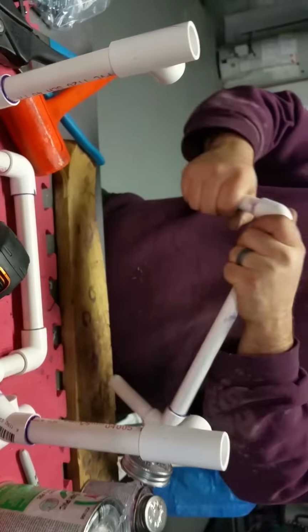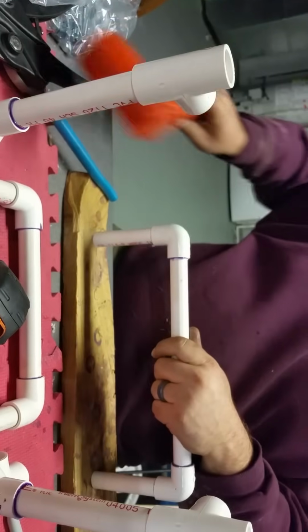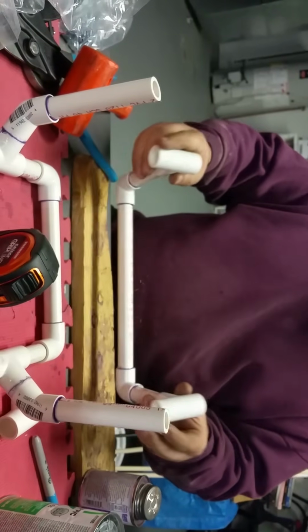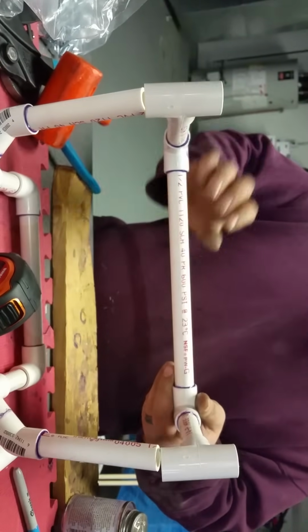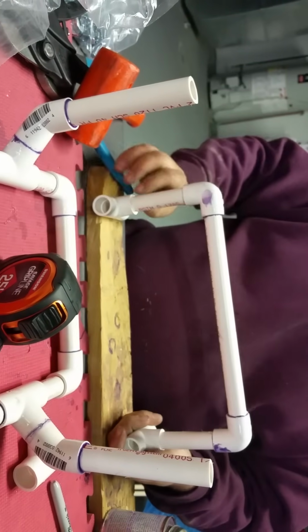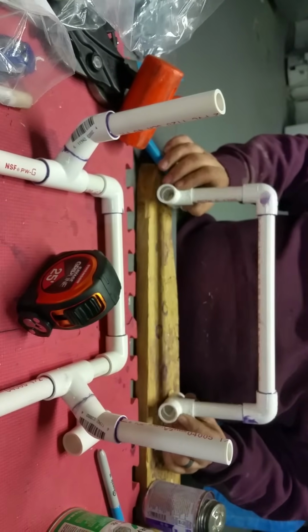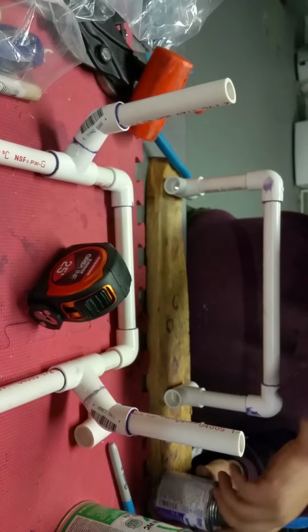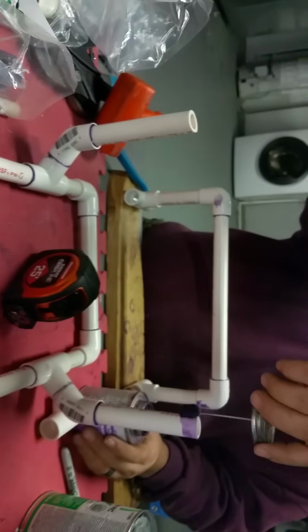So here we're installing the 4-inch PVC pipe pieces. So we took the 2 pieces that we had resting on the top and attached those to the 4-inch pieces. Now we're ready to attach those back onto the leg pieces. So these pieces have been primered and glued onto there before we set them up in their permanent place on the legs. Right now the cart is upside down. We're building it upside down.